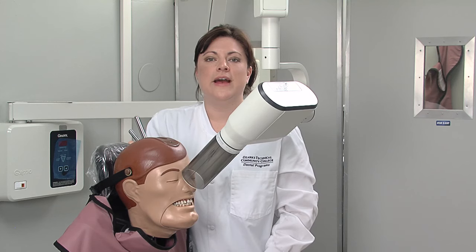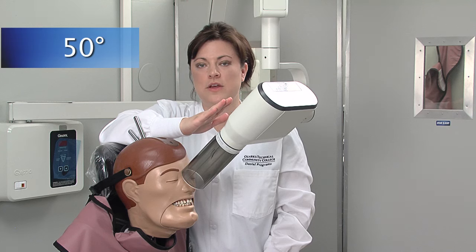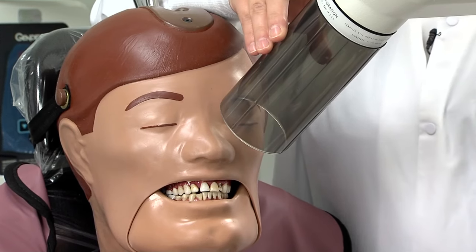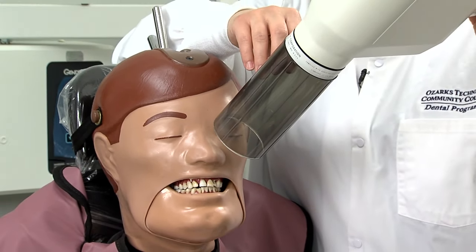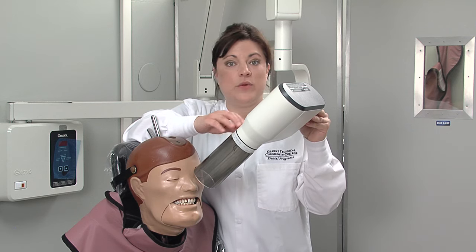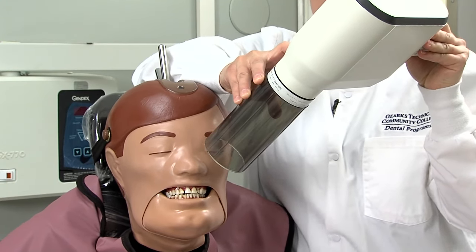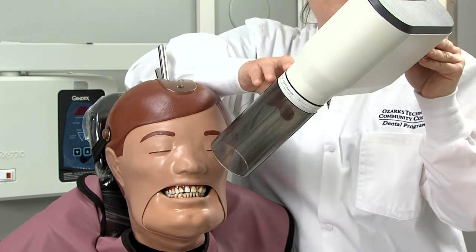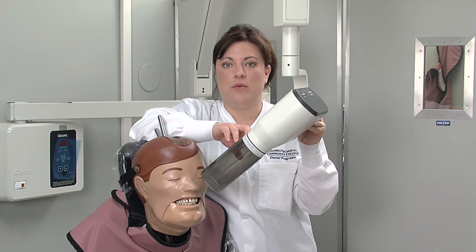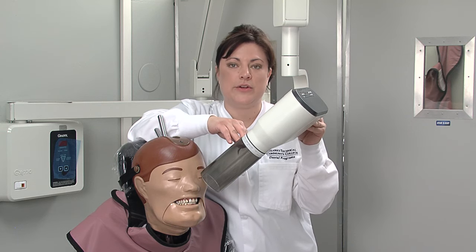Moving on to the maxillary lateral incisor radiograph, we're going to keep the same positive 50-degree angulation, only this time slightly move the PID over so that it's even approximately with the lateral side of the nostril. Then for the canine exposure, we're going to use the same positive degree angulation and just continue rotating around that ala-tragus line, so that it's even further out from the nostril. On all of these, you want to make sure the circle of the PID is covering your film based on your placement.